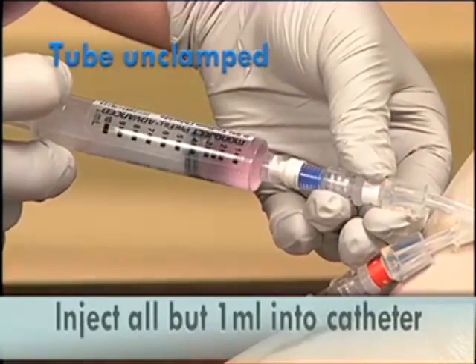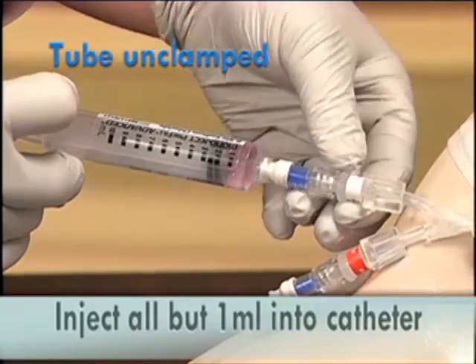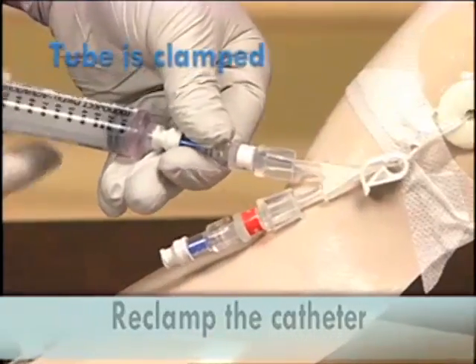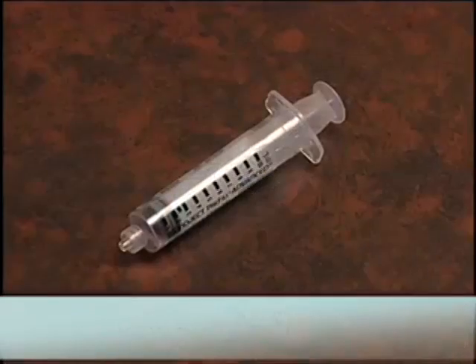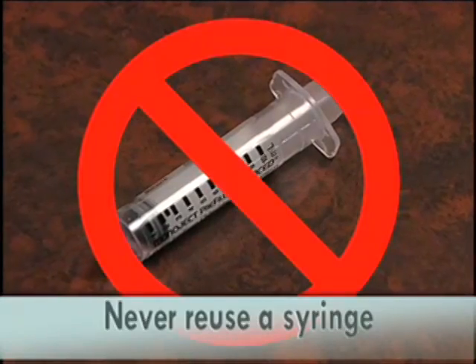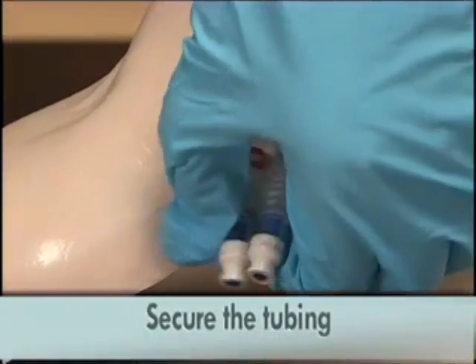When the syringe is almost empty, with approximately 1 milliliter left, reclamp the catheter. Remove the syringe. Dispose of the syringe properly. Never reuse a syringe.